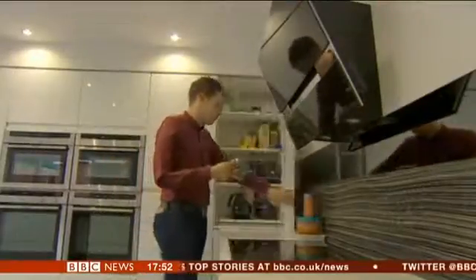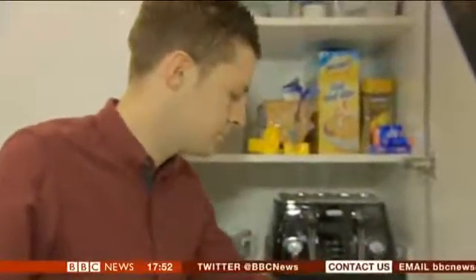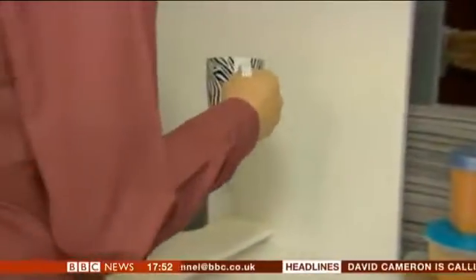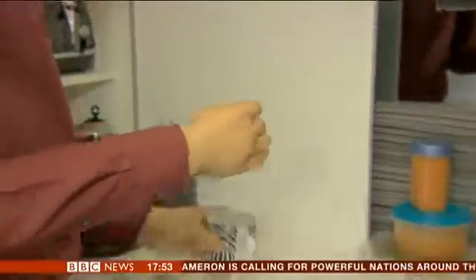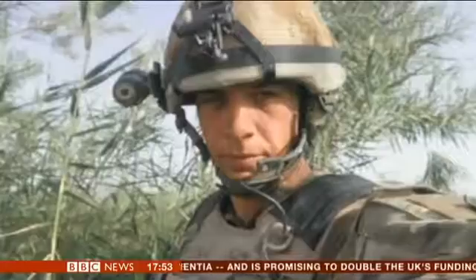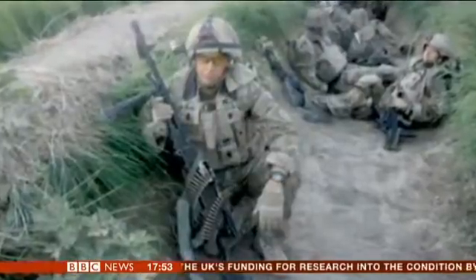It's a simple act, making a cup of tea, but for Corporal Andrew Garthwaite it's a feat of remarkable bionic engineering. The soldier from South Tyneside has one of the most advanced bionic arms in the world, and he's controlling it with his mind. Because obviously I haven't had a thumb or a finger for the last 3 years, and then all of a sudden to start feeling stuff is just a total weird feeling. So you've got to train your brain to actually realise to move this hand. And with the long sleeve, it doesn't look as if you've got a prosthetic arm until it starts making the motor noises itself.